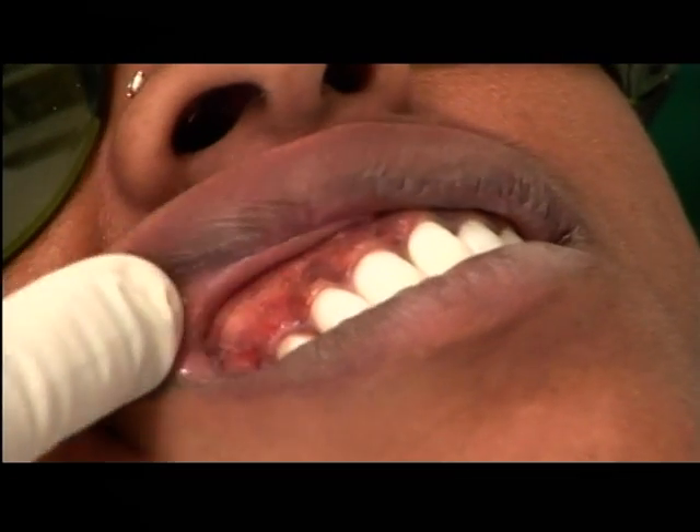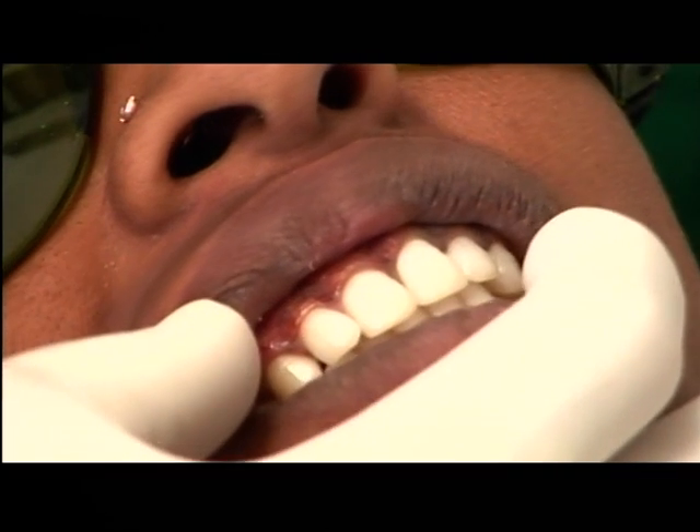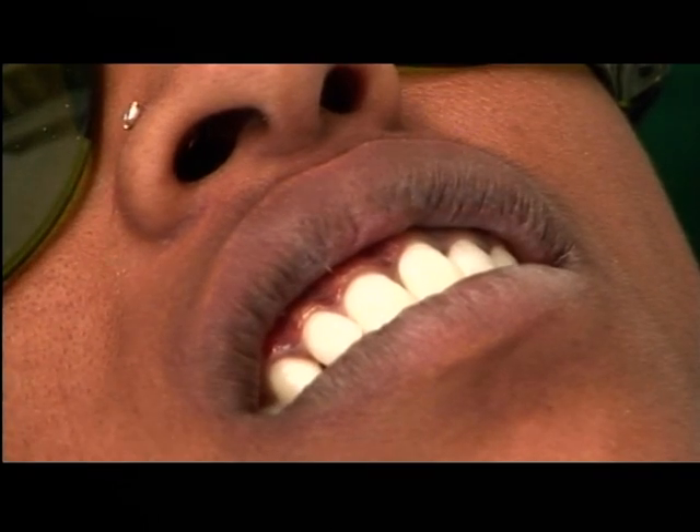So the fiber diameter determines the spot size? Yes. We have done one side. The other side they want to do later — Monday. We'll go to the next case.